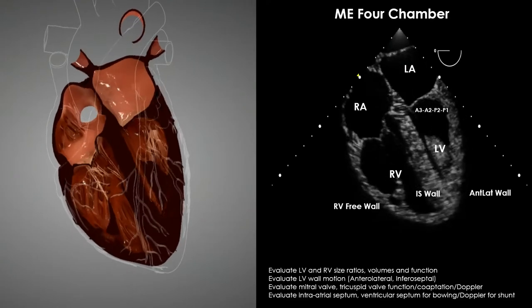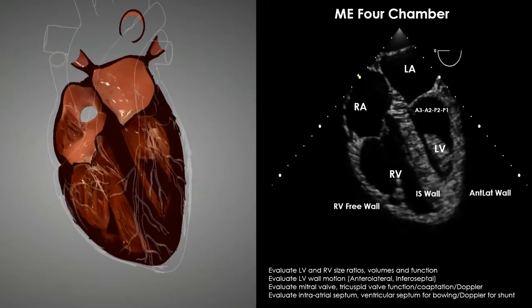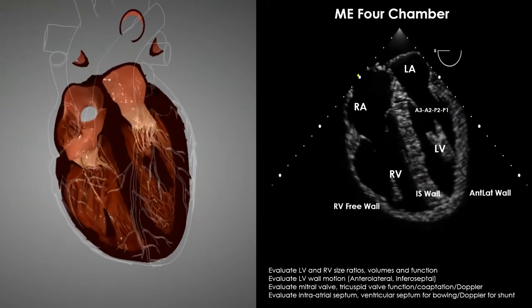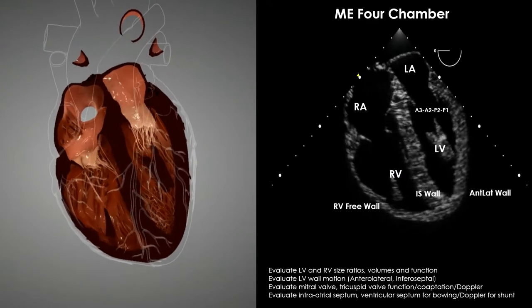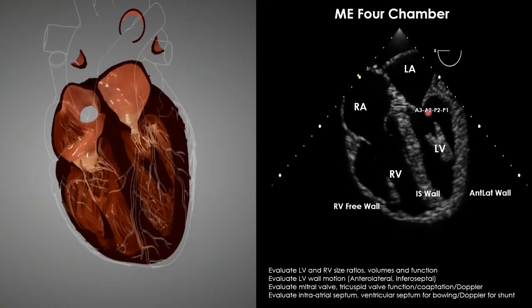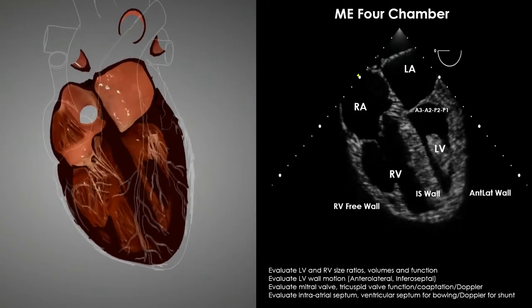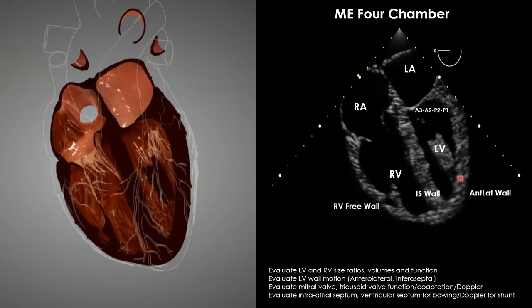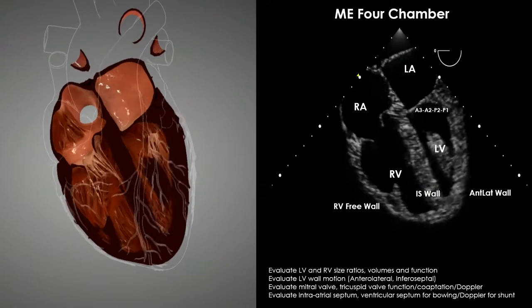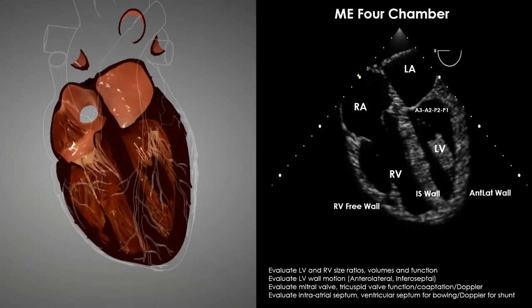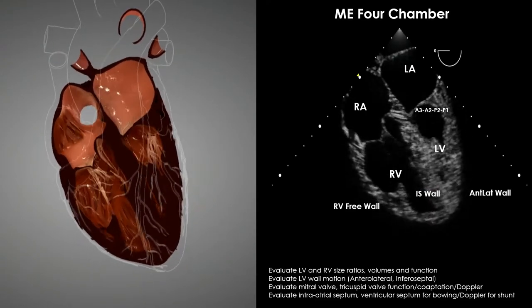In this mid-esophageal four-chamber, what immediately pops out is the RV-to-LV ratio — the RV is actually larger than the LV, indicating RV dysfunction. You then examine coaptation of the mitral valve, potentially adding color Doppler to see if MR is responsible for the large RV, and assess the anterolateral and infero-septal walls for wall motion abnormalities.